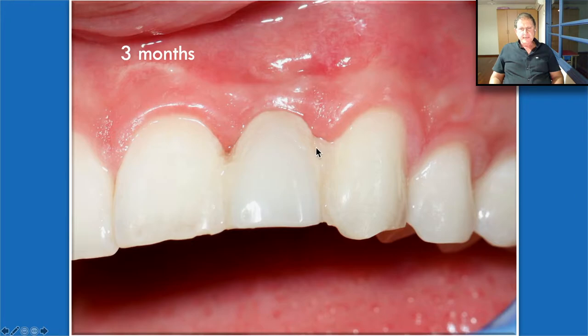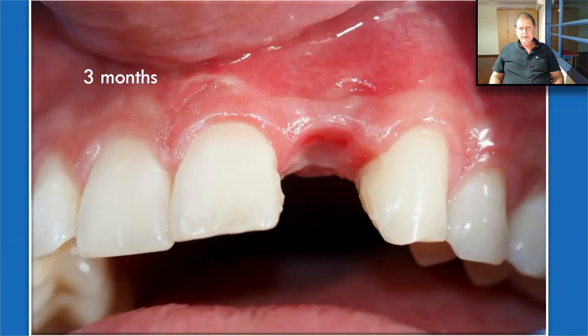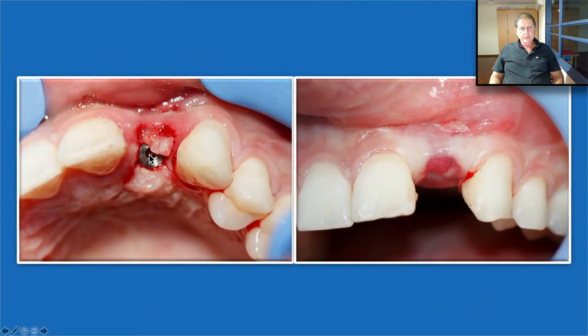The only thing that bothers the papilla is perhaps the bonding of the Maryland bridge, but that can be corrected very easily. Beautiful soft tissue proliferation and the papilla are perfectly in place when we remove the Maryland bridge — that is keratinized tissue. It was a very simple procedure but maintains a very high standard of treatment in the aesthetic zone, and of course, it's not invasive. Bond Apatite transforms into patient's own bone, especially when well protected. And at this stage we can place an implant.